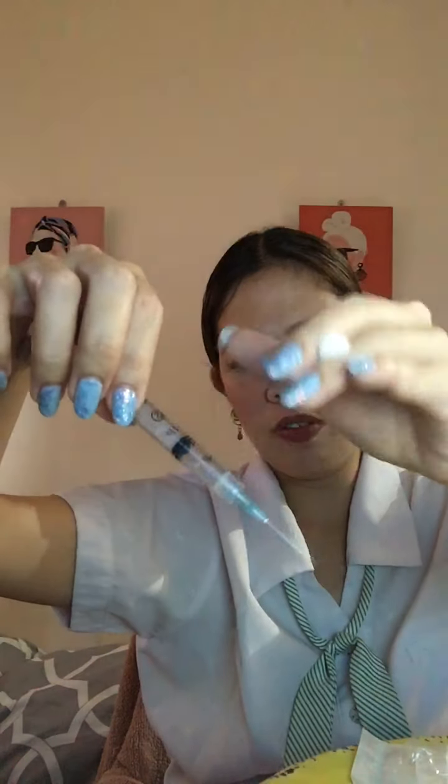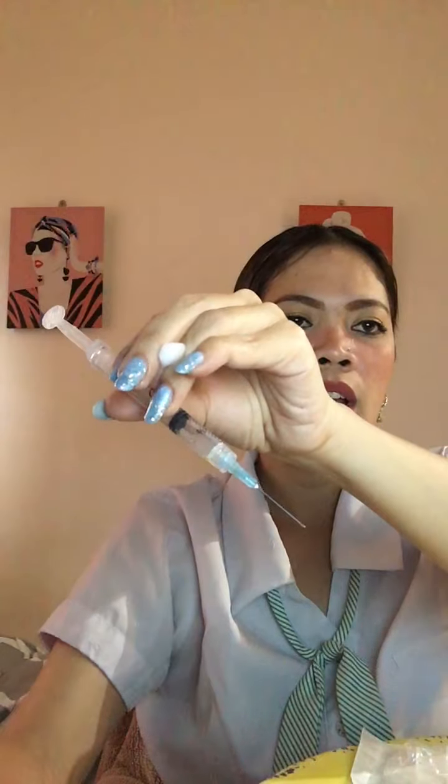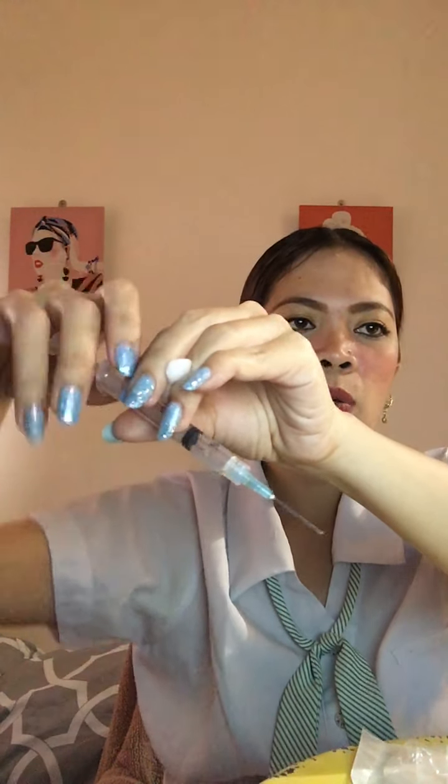So first you do this, then release, then aspirate, then you have to make sure that there's no blood inside the syringe. Now quickly withdraw the needle by applying pressure with the antiseptic pad. So withdraw it quickly, and then put the antiseptic pad on the injection site.